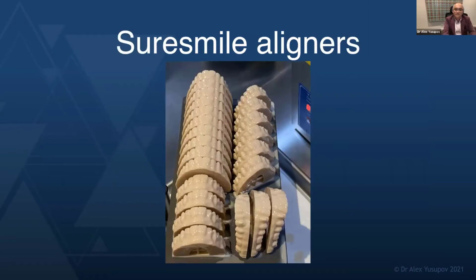Sure Smile aligners, I was kind of hoping to include some of that in today's presentation, but I'll probably do another webinar if I'm invited, just on how to print aligner models in the maximum way, standing up without having breakages. And we've developed a little workflow that I'll share with everybody at some later date.